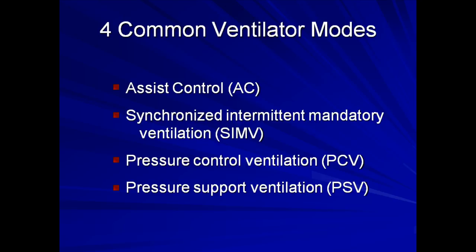As I mentioned at the beginning of this lecture, there is a severe lack of consistency with mode terminology. Therefore, what I am referring to as pressure-controlled ventilation may be called something different by other clinicians. Also, in common usage, the terms assist control and SIMV imply volume-targeted ventilation. However, pressure-targeted assist control and SIMV also exist, though they are much more rarely used.